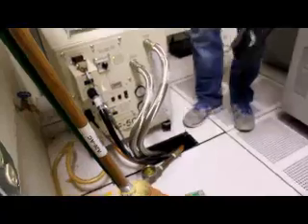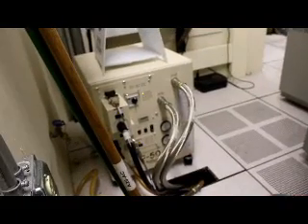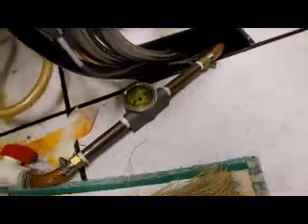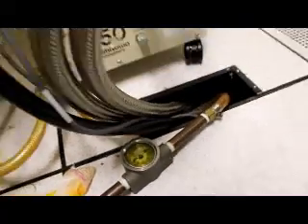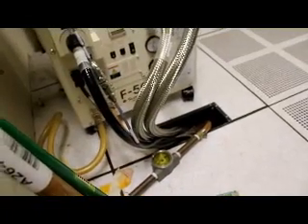And what's this right here? This right here is the helium. This is your helium unit. It's got a compressor. It'll handle the magnet for 1 hour if the chillers were to shut off. It's got 1 hour of time that'll keep them cooling. And this is your glycol, and you want to see that that's spinning, and then it's yellow. Yeah. Then if they don't have a city water bypass, then they have to shut the machine off or else it'll burn it off.